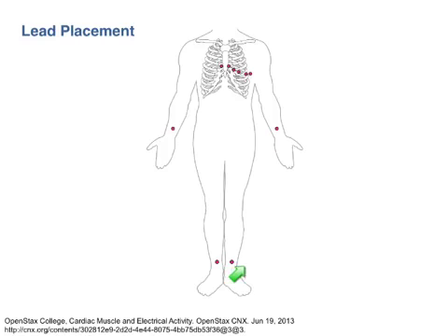The information from all of these electrodes, also called leads, is all integrated to form the EKG pattern. The subject is usually asked to remain still during the EKG and maybe even to hold their breath so that the electrical activity of contracting muscles doesn't interfere with the EKG reading.